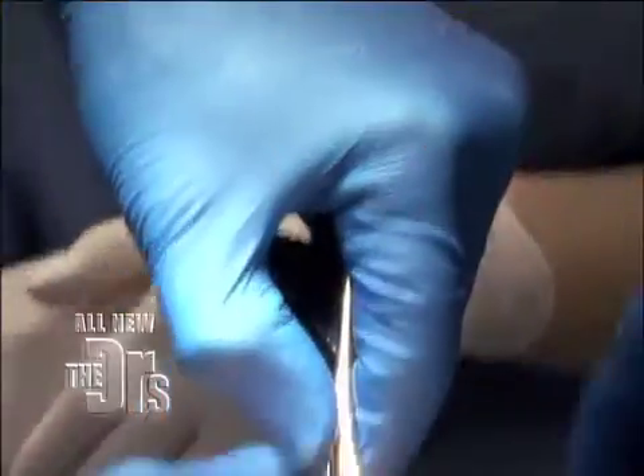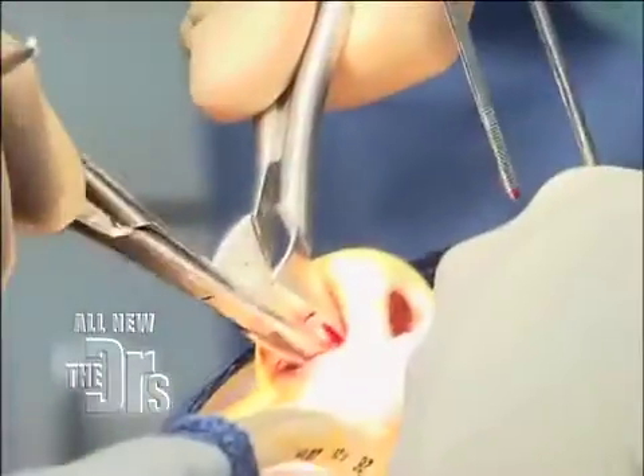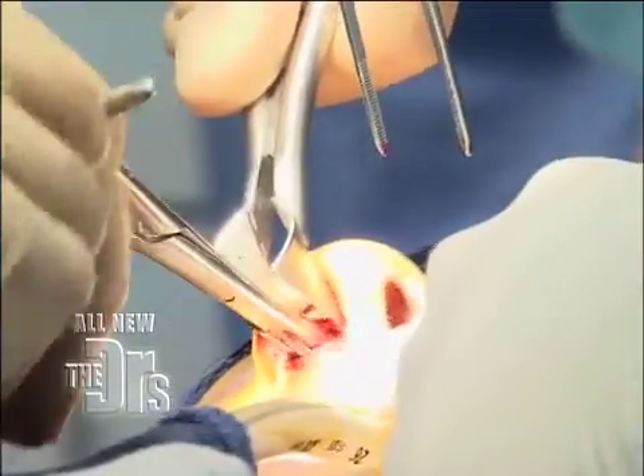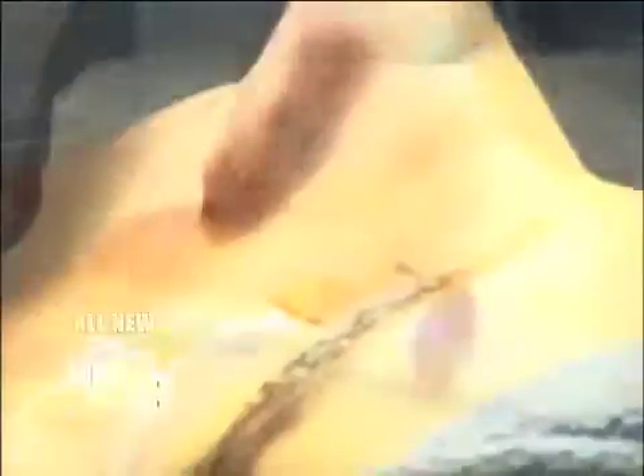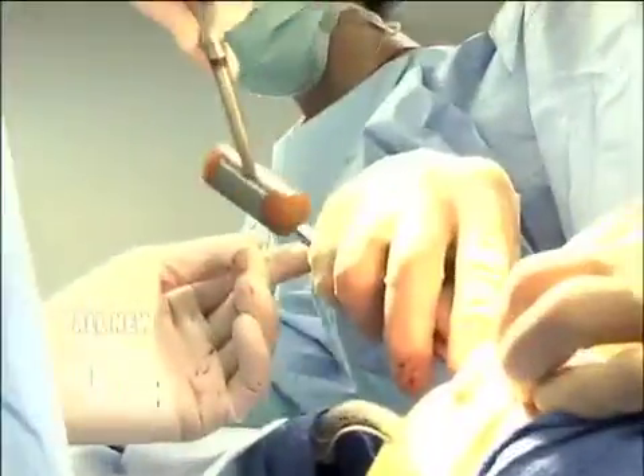I think we actually even had some B-roll during the surgery itself. And walk us through what we're looking at here, because we couldn't fully understand. So right here we're injecting the nose so there's no bleeding. Right now we're taking out some of her crooked septum, which is causing her to have poor breathing problems. Part of that's bone and part of that is cartilage, but once we take it out, we narrow her nose to give her a more refined, sophisticated nose — but one that really fits her face.